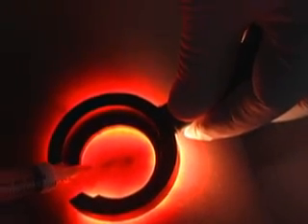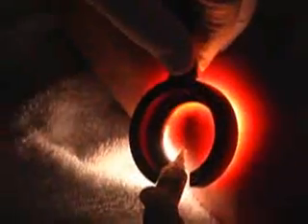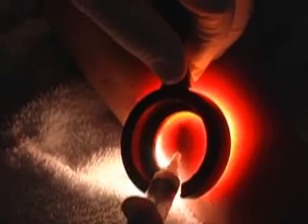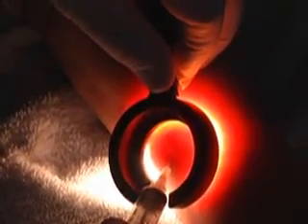it. It's really kind of fun to do, because as we inject the foam solution into the vein, it disperses the blood that's in the vein, and so for a few instants it completely disappears, and the vein appears to be gone. Unfortunately, it refills with blood, and we have to go through the process of making it heal by compression and walking and healing that.